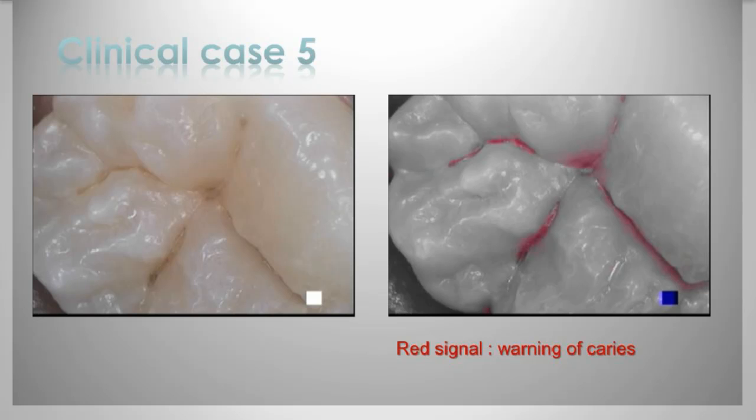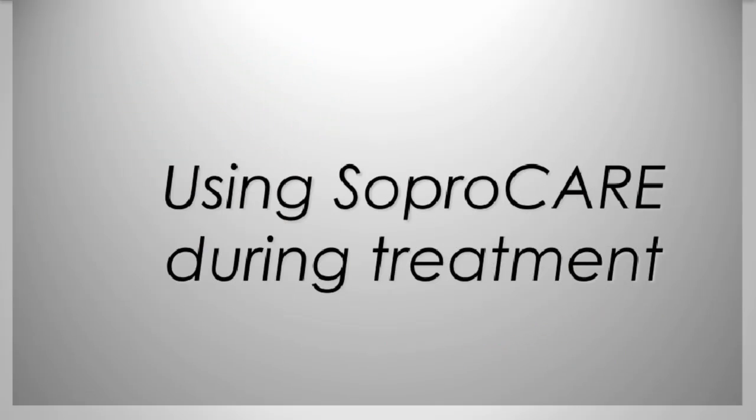And I have another practice where I work, and we have a lot of elderly patients, and finances make them kind of restrict their x-ray exposure, and sometimes even health-wise, people are going through chemotherapy and things like that. And again, this is my world, what I experienced, and this actually just happened this week too. And when they have something that they don't want an x-ray for, at least I can get my doctor a picture with the intraoral camera and putting it on the caries mode. So this is really exciting for the doctors out there, using this technology during treatment.